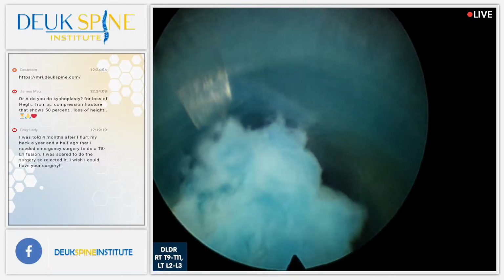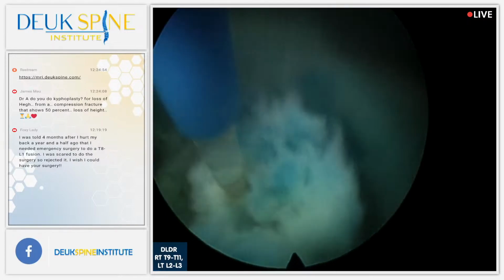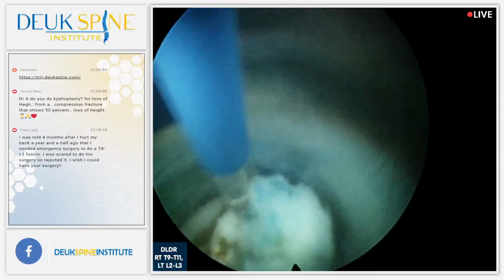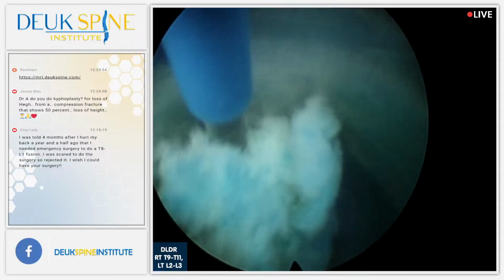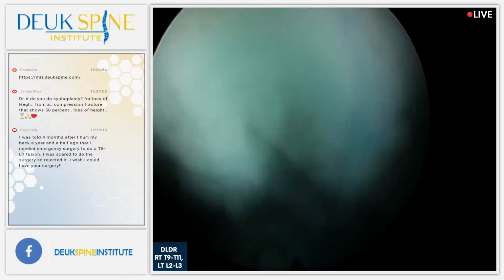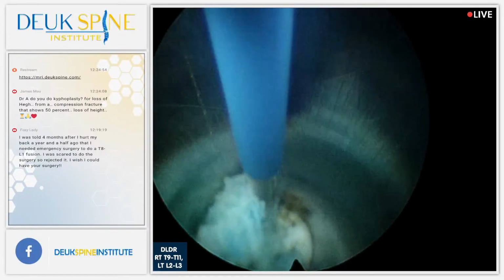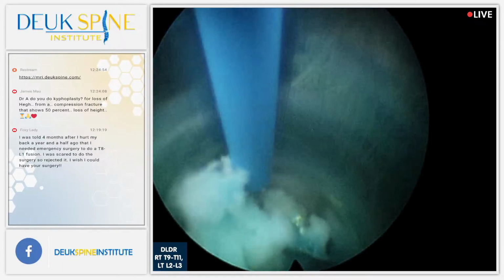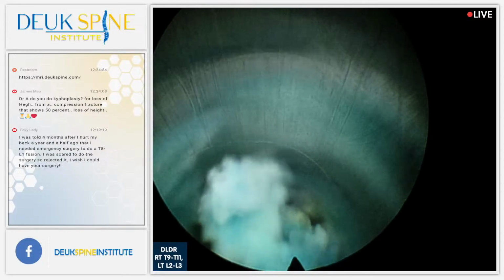Laser, laser. Thank you. All right. Any questions? No current questions. Beautiful. All right. Well, so far so good. We got 10 minutes left and we'll be out of here on to number 3 for the day. This is a piece of herniation. Look at the calcification and scarring of that piece back there I was just working on.